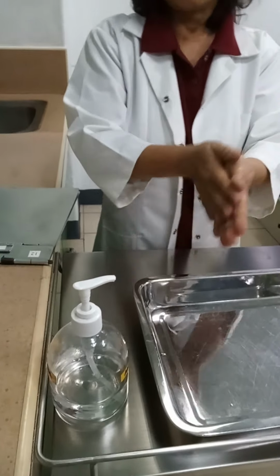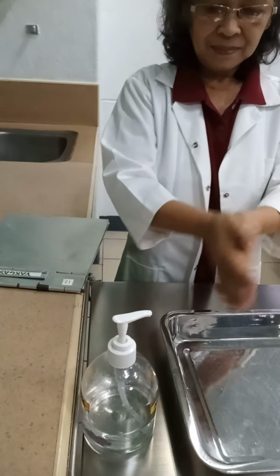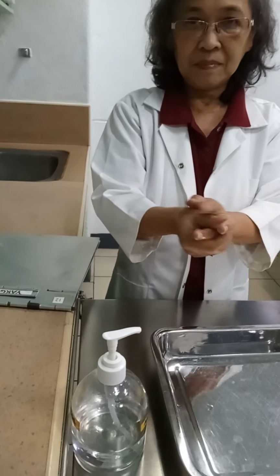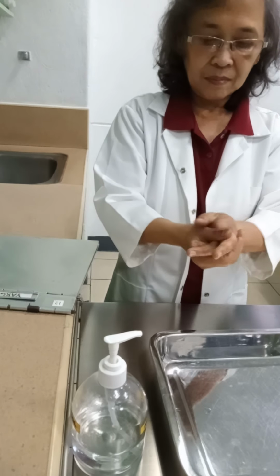So that is withdrawing and reconstituting medications from ampoules, vials in liquid form, and in reconstituting vials in powdered form.